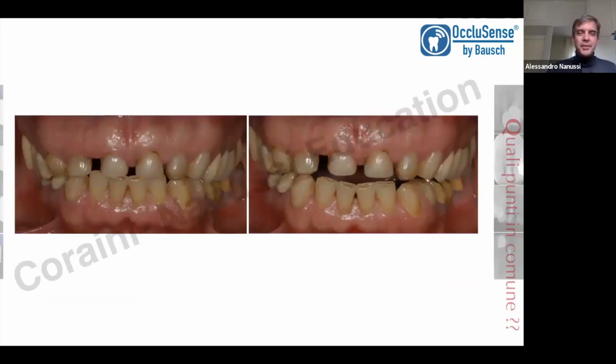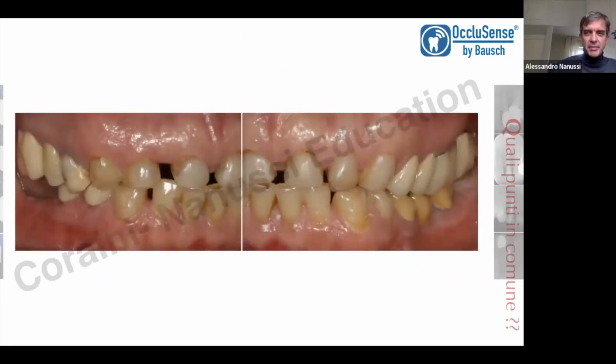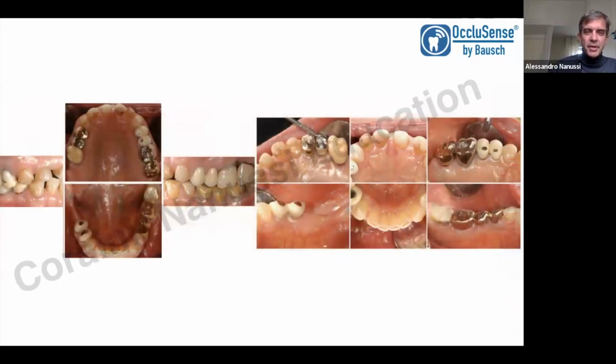And now I show you another prosthodontic case. This patient is really strong. He's an old man, 60 years old, but his life is really active and he is a grinding person. This case has been managed with my super partner, Christian Coraini. You can see the situation of the teeth and also all the restoration of prosthodontic treatment and an occlusion that is not balanced.